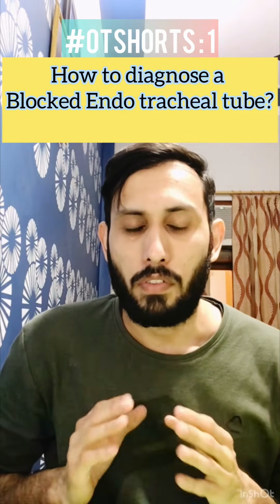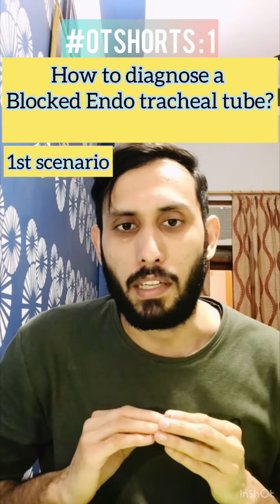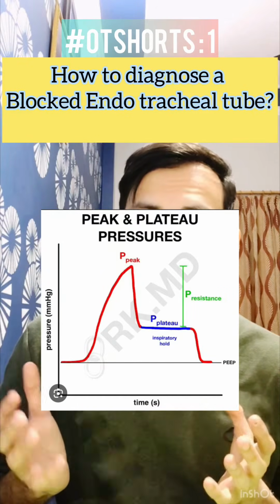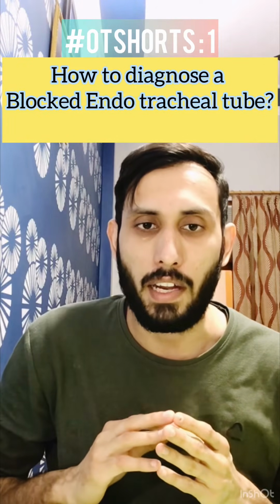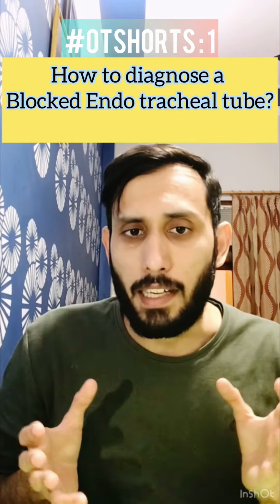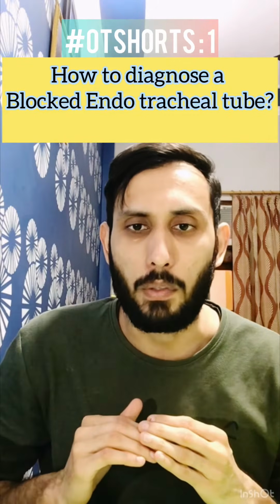Now, the first scenario is when you have inserted the tube yourself, you know the adequate depth of insertion, you know there is bilateral air entry, the peak pressures are normal on the ventilator, the end tidal CO2 curve and the value is fine, the oxygen saturation is fine. So ultimately you know the baseline of the patient. Even if the chest is poor, you know what the baseline values were.